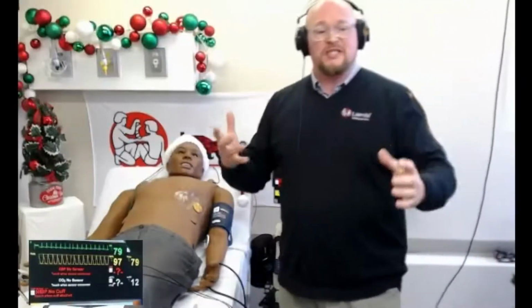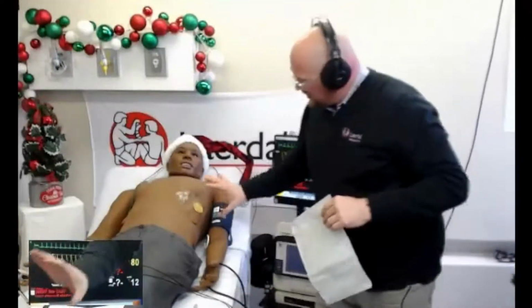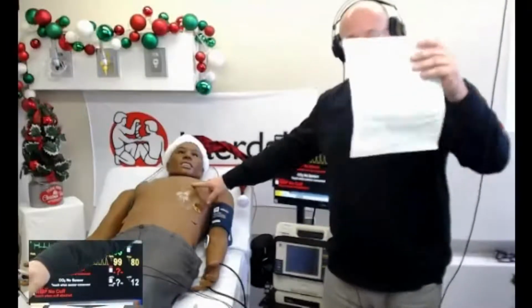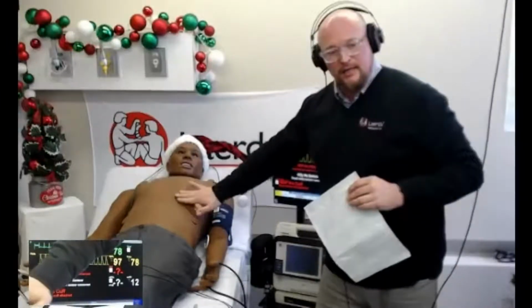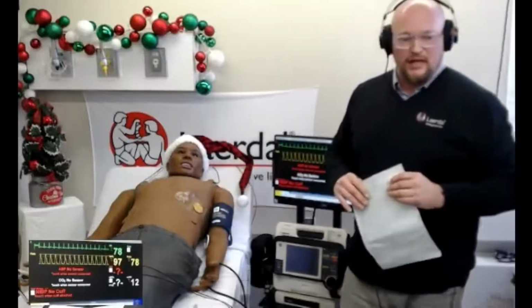But silicone, what sticks to silicone? Silicone. So silicone dressings are your key. The reason is that the defibrillation pad adhesive is not going to stick to silicone. So we take a silicone base, stick it to the silicone, change the surface, and now the defibrillation pads will actually stick to them.